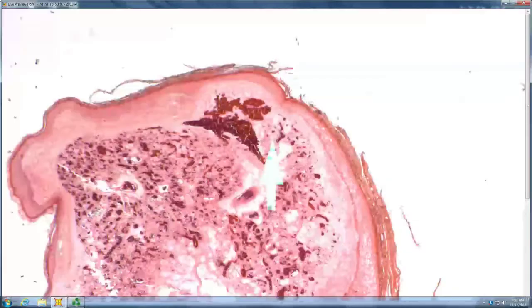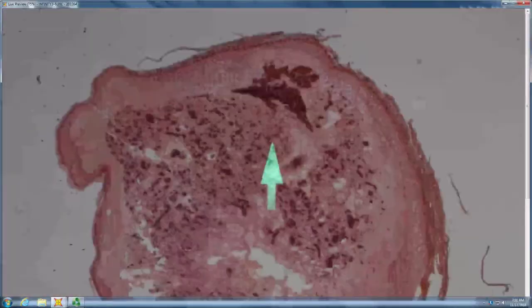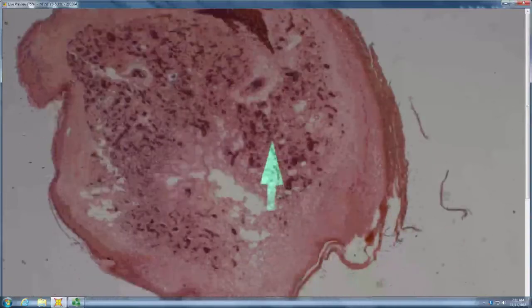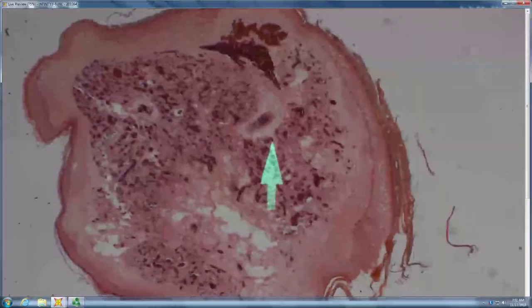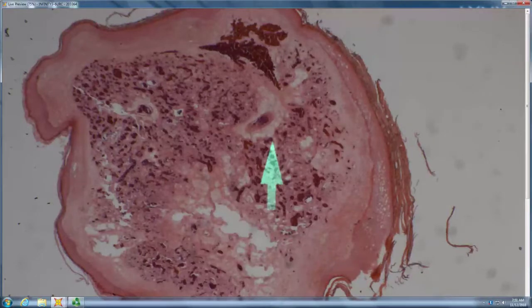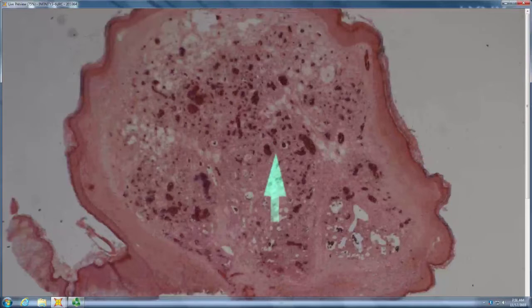Looks like a vascular proliferation. And what do you think the lesion was like? Probably had a little collar of scale. Yeah, either a bump that was shaved off, or the lesion is long, skinny, cylindrical, like a worm. Probably the first one in this case. And so, probably a PG.